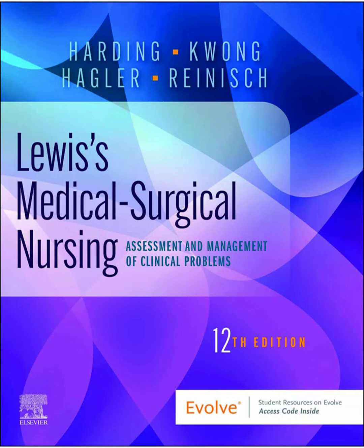How do they diagnose that specific type? If the history isn't clear, a key test is the head-up tilt test. They strap the patient safely to a table, monitor their ECG, blood pressure, and heart rate continuously, and then tilt the table upright for a period, maybe 20 to 60 minutes. To try and provoke it. Exactly. A positive test is when tilting reproduces the patient's symptoms, like feeling faint, along with those characteristic abnormal drops in heart rate and/or blood pressure.